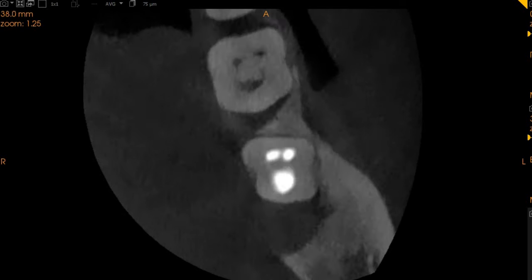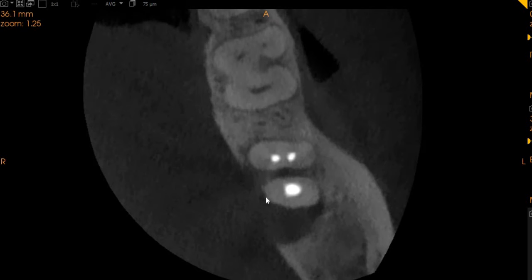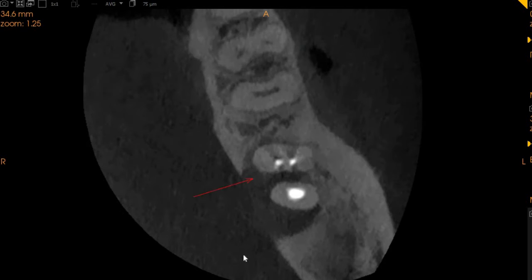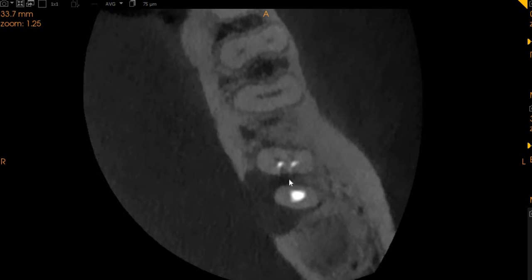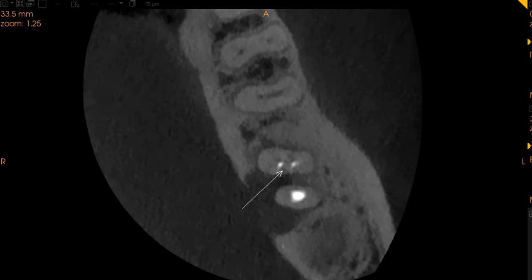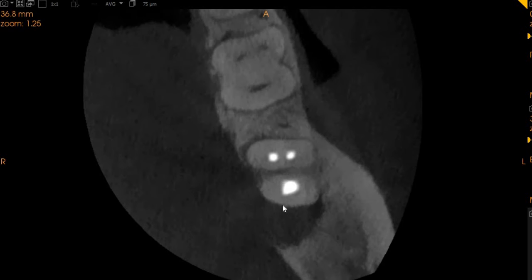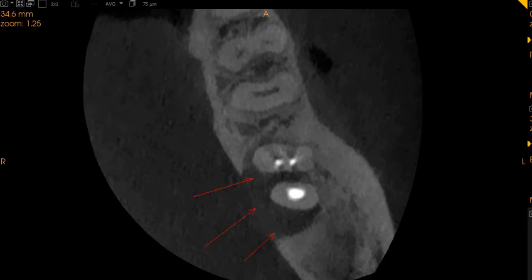The periapical radiolucency has led to immense resorption of the lingual cortical plate, which can be seen here. This tooth does not seem to be salvageable. We can see that there is a crack line extending in the mesial root of the tooth, and the interradicular area appears to be quite significantly disturbed as well. The major radiolucency is extending from the distal aspect of the tooth.